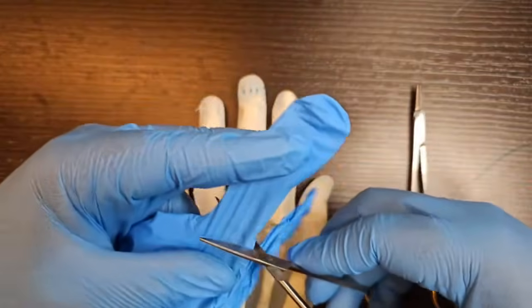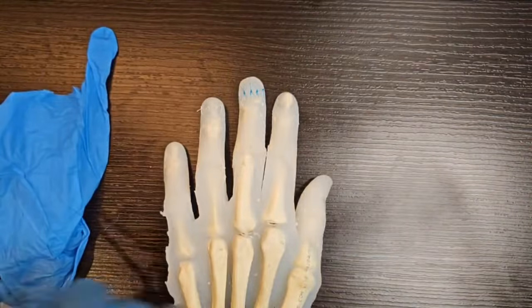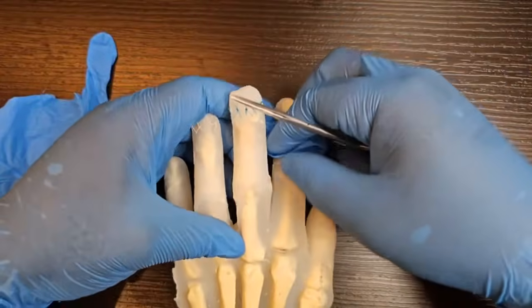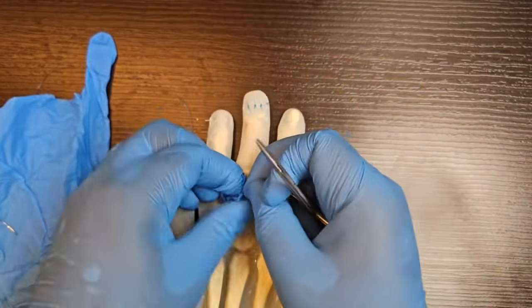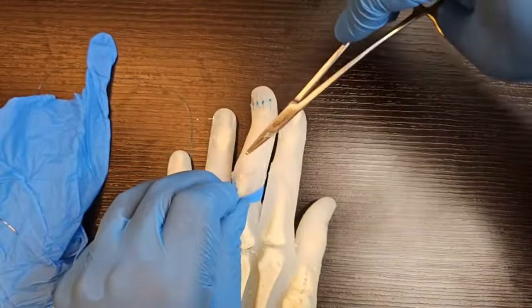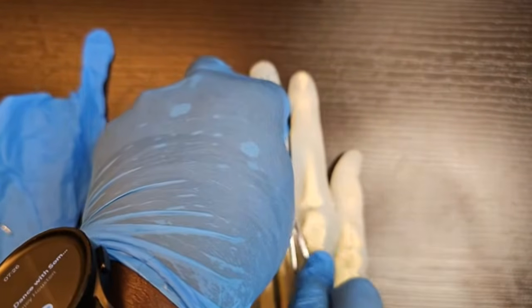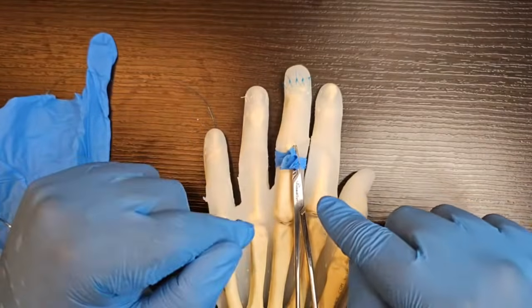You cut a portion of it. You get an artery clip or a second needle holder, and you place that. This is a 2 people job, but I'm a solo surgeon on YouTube. You pull. A common pitfall: people put the clip this way. Don't do that, it'll get in your way. Put it on this way. And the tourniquet is on.